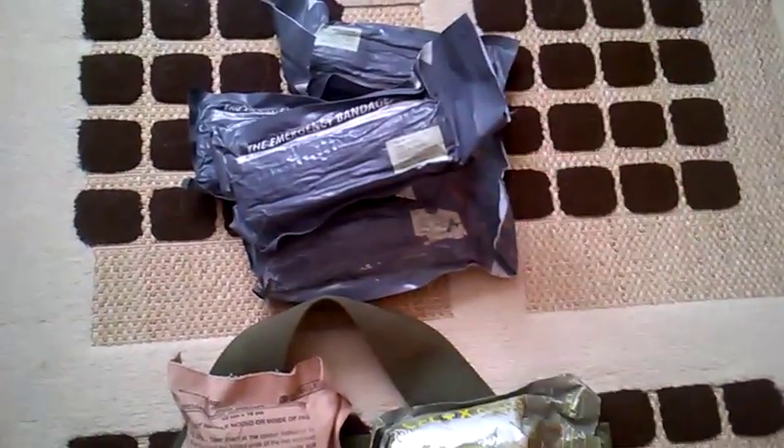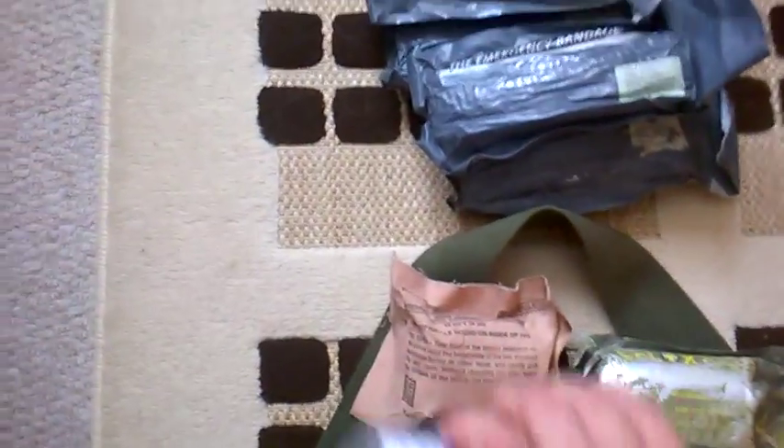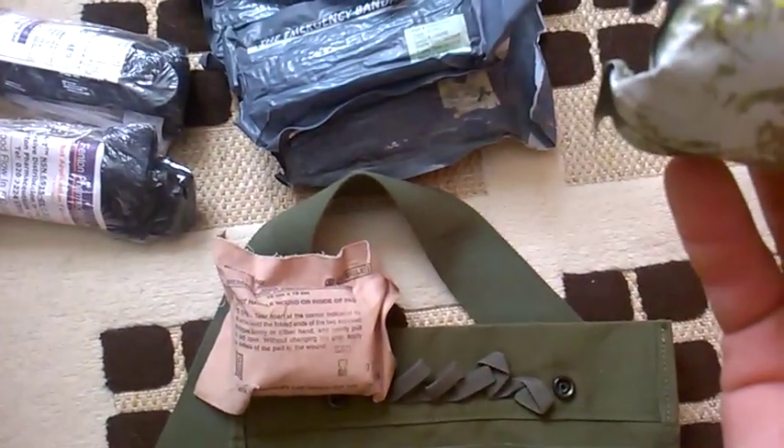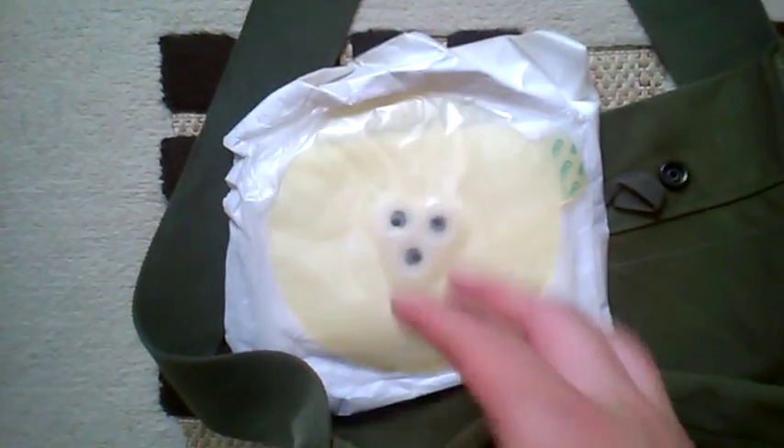In the other pouch we've got another four Israeli bandages, bringing the total to five Israeli bandages. And this here — flip it over to show you the other side — this is a Bolin chest seal, a sucking chest wound dressing. It's basically a valve which goes over a massive hole in your chest and allows the patient to continue breathing.